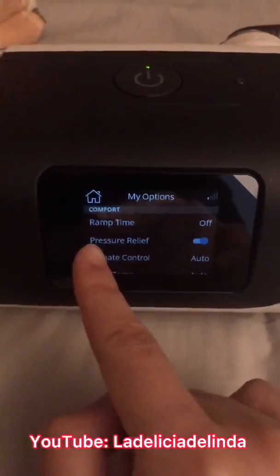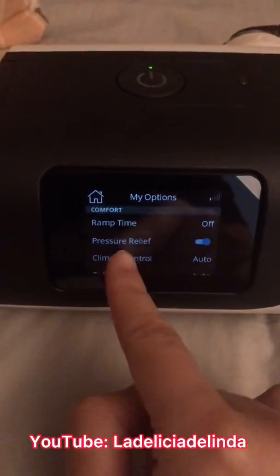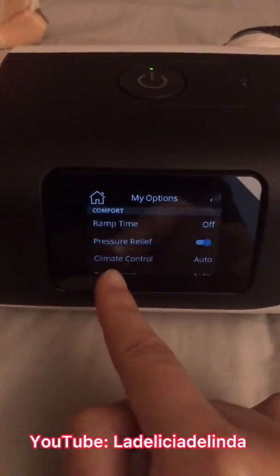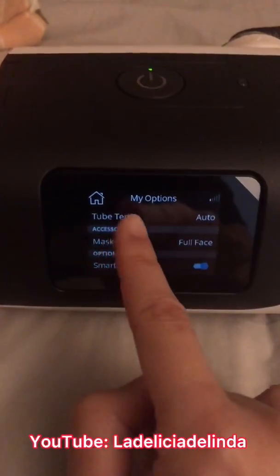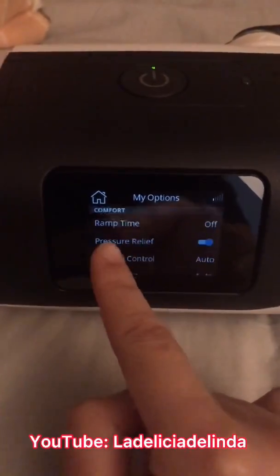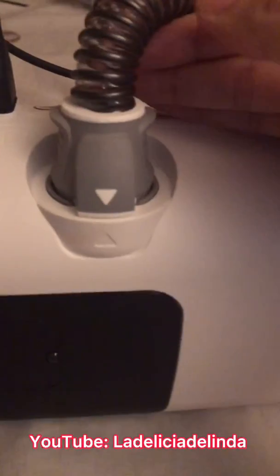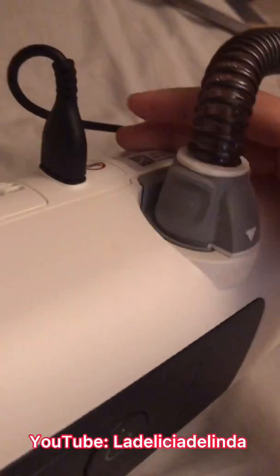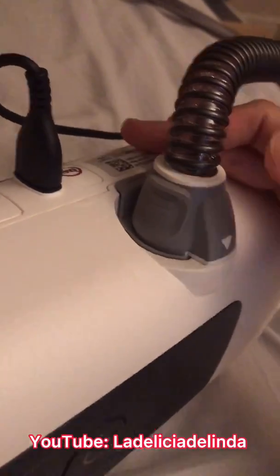The normal features you can adjust include ramp time, you can turn on pressure relief, and I have climate control here because I do have the heated tubing. Do note that the heated tubing on the 11 is not the same as the heated tubing on the 10.